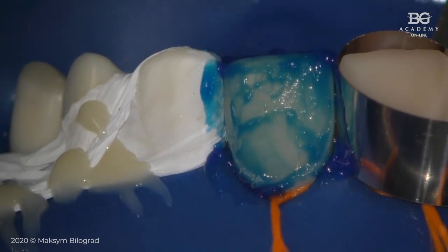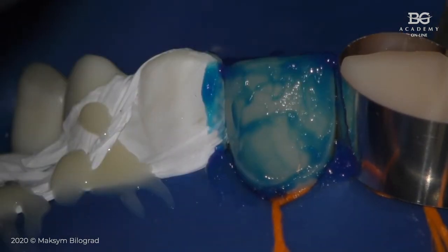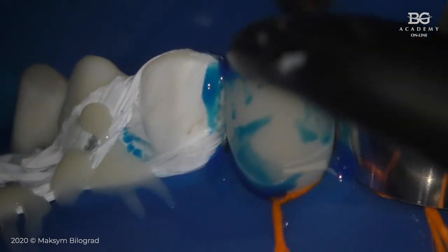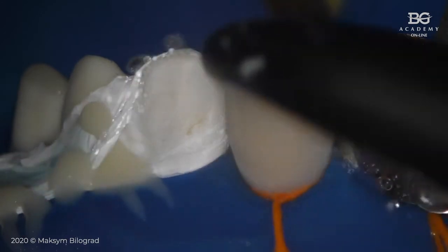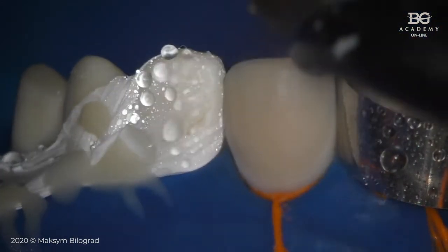Okay, and then we just wait 30 seconds. And then we will rinse. And then we will dry.